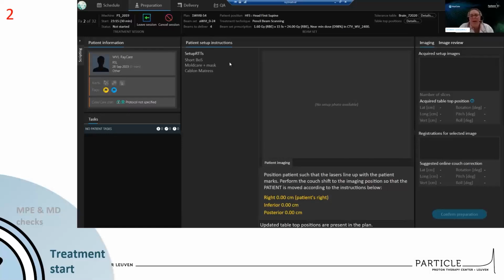And that's partly thanks to our housekeeping or tidying up steps earlier on, where we remove unnecessary planning or optimization RT structs from export. So doing this step definitely shortens this transfer time.